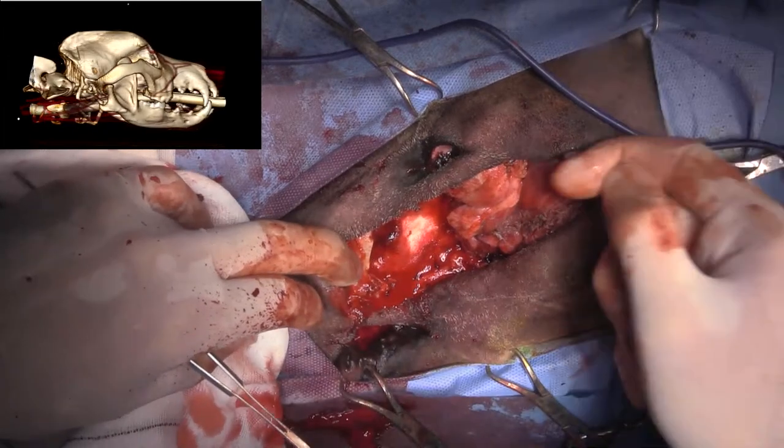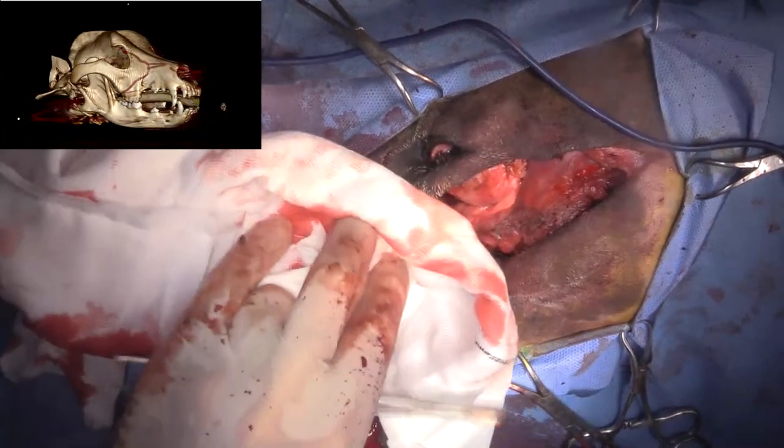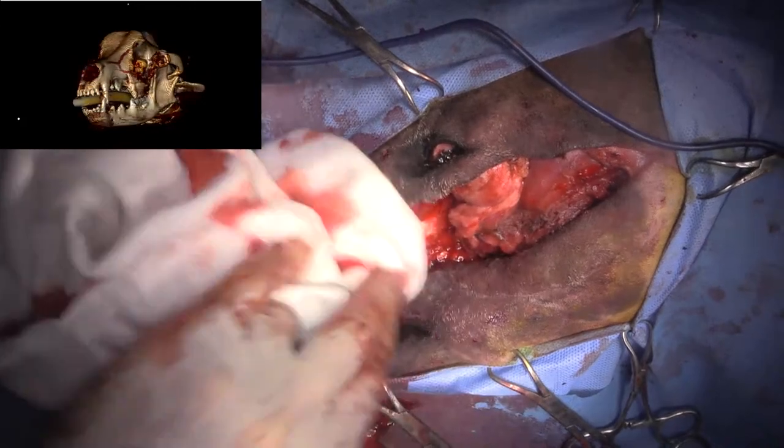So put in a closed suction drain, little hole right there, and then tack that up, and then just close sub-Q and skin intradermal. Okay. You're happy to do that? Do you want to do it?